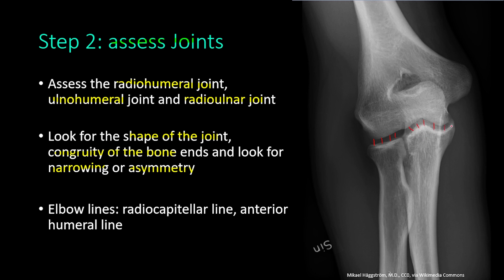For the ulno-humeral joint, you observe the joint space, check for narrowing or asymmetry, check the shape, and check the congruity of the bone ends — it looks normal here. The same applies for the radio-ulnar joint, which also looks normal.